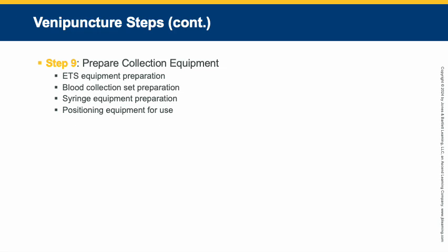Do not place your phlebotomy tray on the patient's bed or any other place that could be contaminated by it. If you set it on the patient's bedside table, place it on a clean paper towel, okay, before you do that.